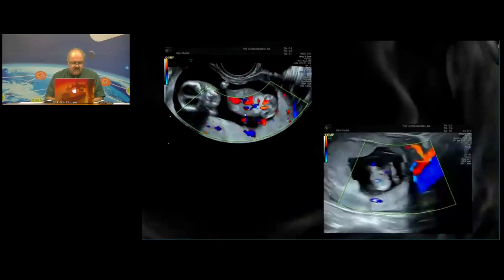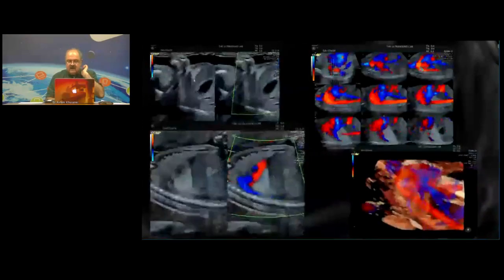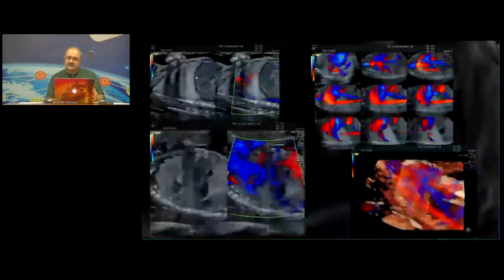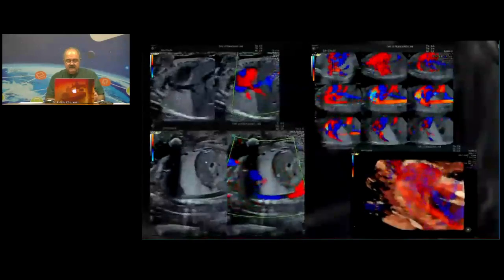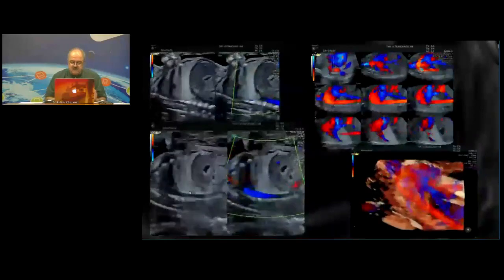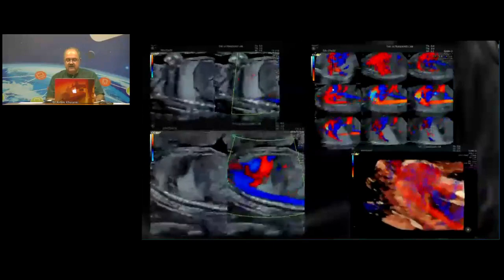Another example. I want to know whether a lesion here in the thorax looks triangular. And I was thinking more in terms of a sequestration, which has a different prognosis from a CPAM. Because it was basal and it was triangular, I was thinking of a sequestration. The moment I switch on color, I realize that the aorta is completely clean.